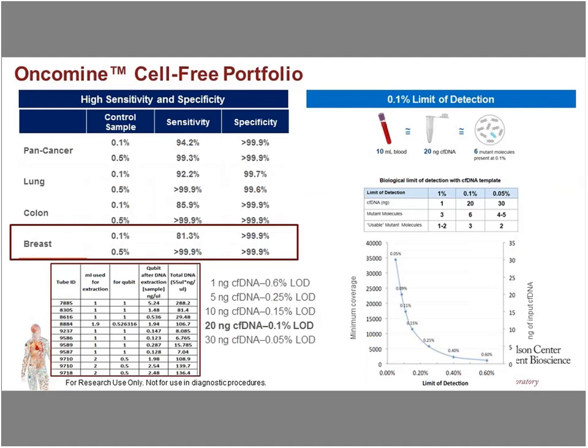Since we quantify every cfDNA sample we get, we always reference back to the quantifications of cfDNA and keep the sample's limit in mind, especially when the frequencies of detected variant is on the borderline.